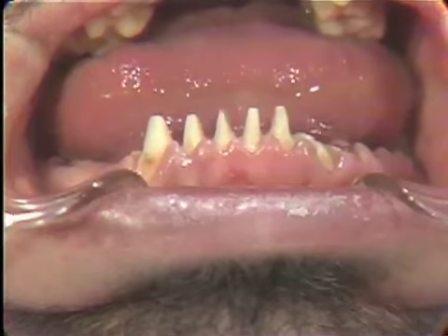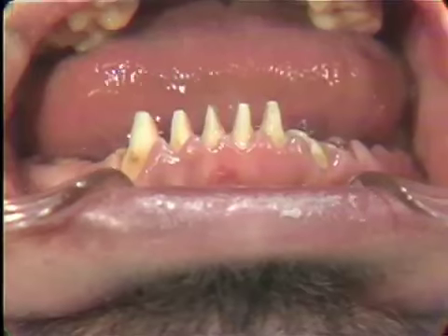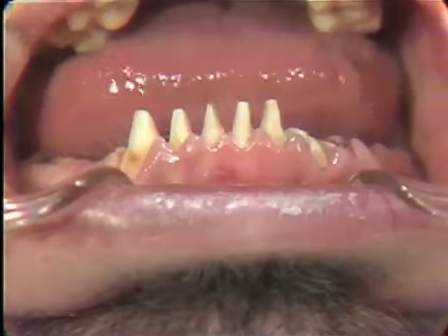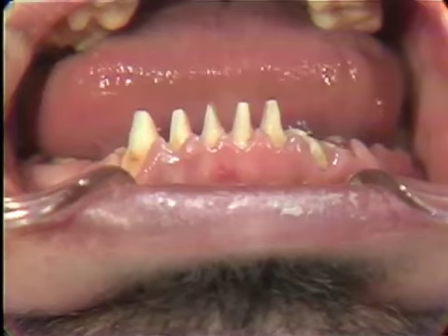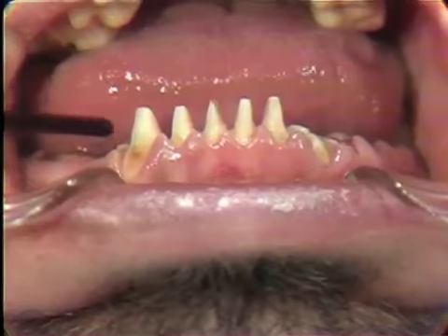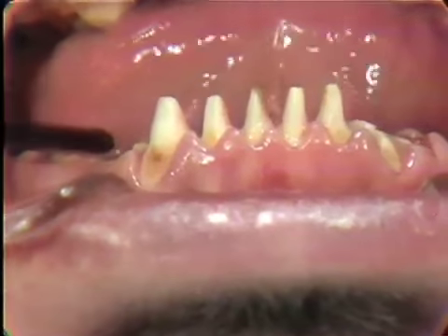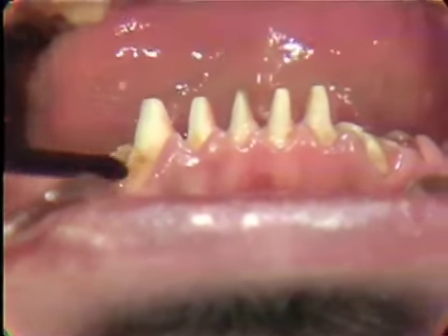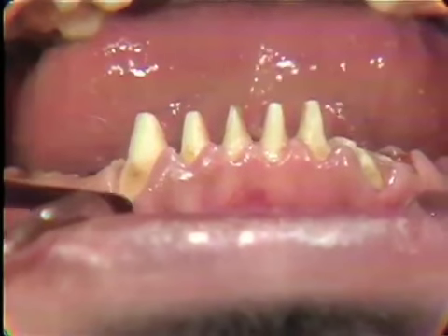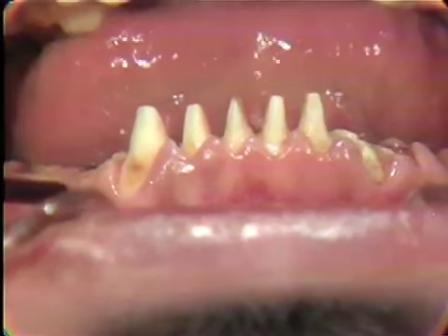The idea of the temporary is to keep the tooth from moving orthodontically. This means that there must be excellent occlusion on the temporaries, and that also must be compatible with the tissue, so that we don't cause any inflammation in the tissue. If we cause inflammation in the tissue, then we're going to have the tooth out of position, or we're going to cause some periodontal problems with the teeth by the time we get the restorations finished. So as you see here, the tissue is fairly healthy, fairly normal, even though temporaries have been in this mouth for a period of time.